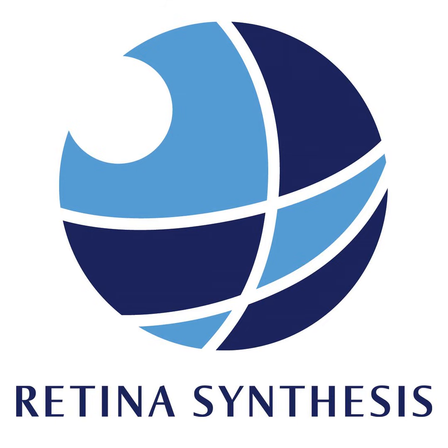One is just financial and common sense practicality of having a trained photographer to do an FA versus an OCTA. Two is the disease processes are more involved in the periphery than we thought. And I think that's something we're starting to realize with wider field imaging in general, OCTA specifically for vascular diseases. So what are the technical requirements for wide field OCTA?